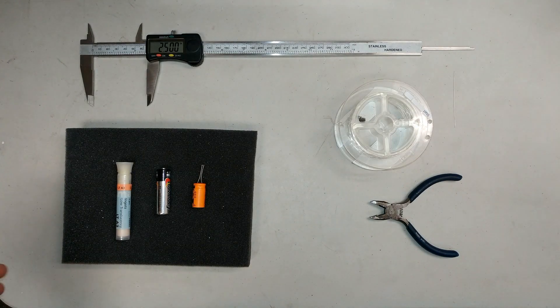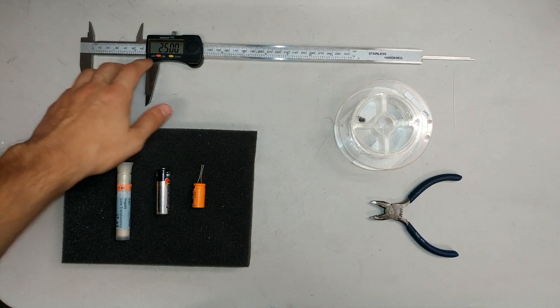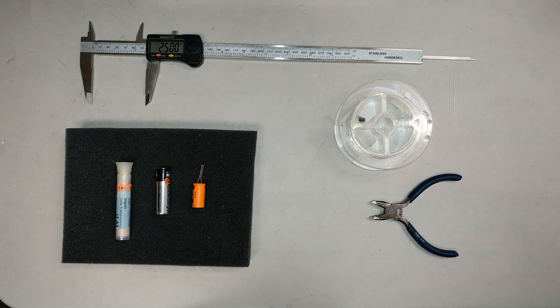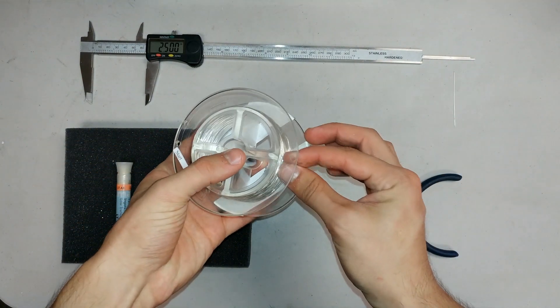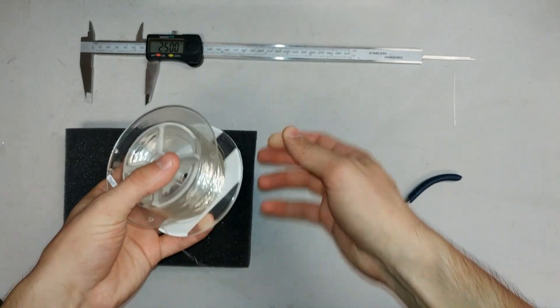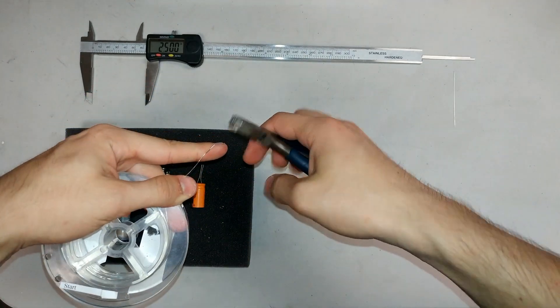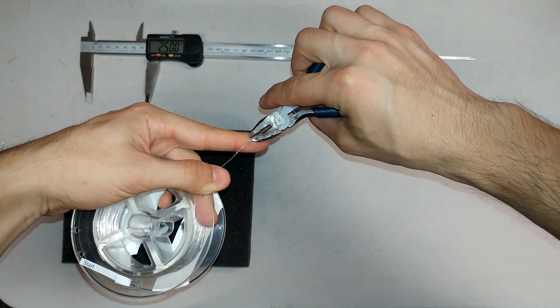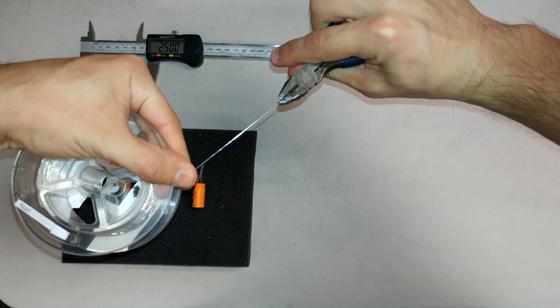The first thing you are going to want to do is take your micrometers and set it to two and a half inches. Once you have it set, go ahead and take your silver wire as well as your pair of pliers. You are going to move the silver wire from how it is locked up and use one hand to hold one end and the other hand to use the pair of pliers, pulling on the silver wire to straighten it out.